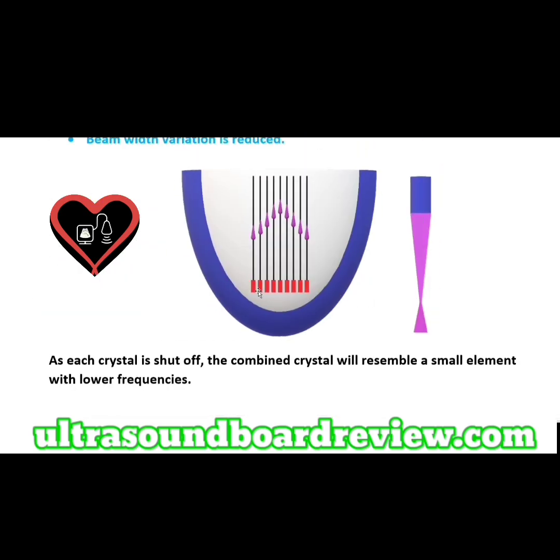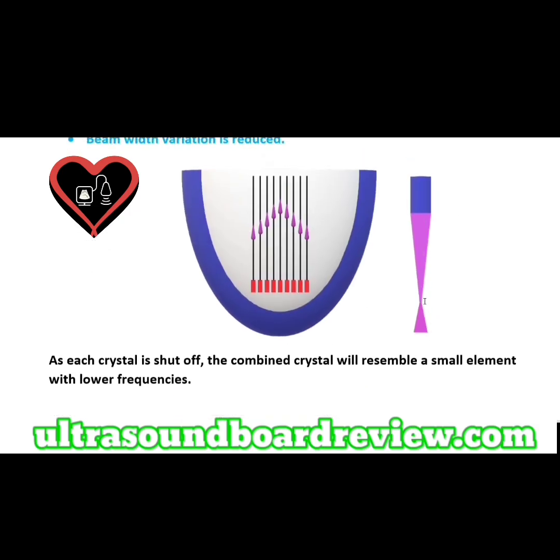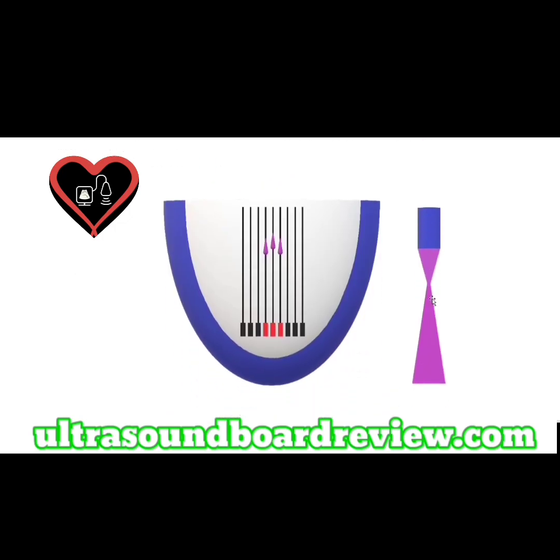If we start over, we have all the crystals firing, which extends our near field, and the focus is right there. That's where our lateral resolution will be the best. If we shut off the outside crystals, focus will be right there, which means our lateral resolution will be best right there, and no longer right here. If we continue to shut off the crystals, our lateral resolution will be the best right here, and then in this image right here, our lateral resolution will be the best right here, because we shut off these crystals.